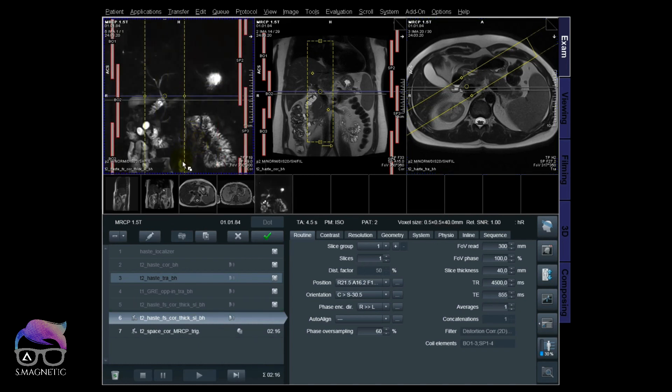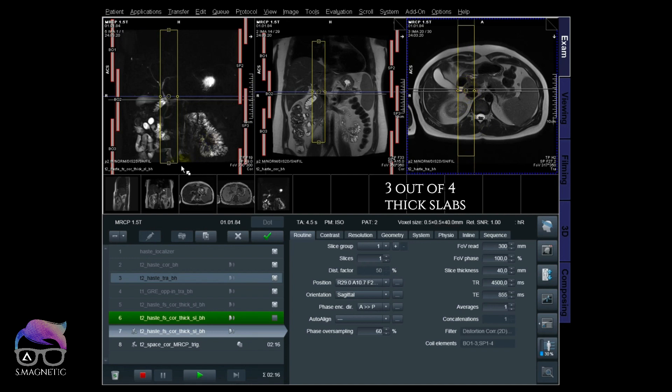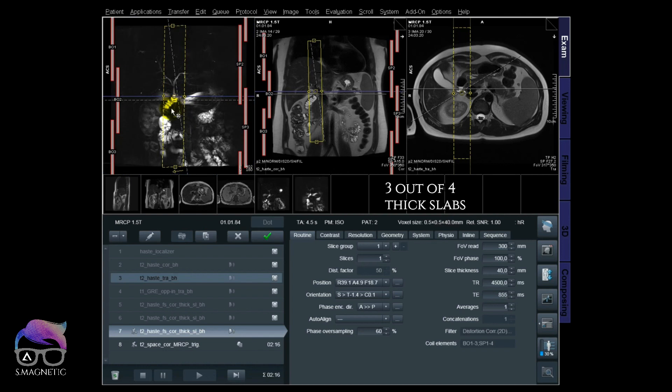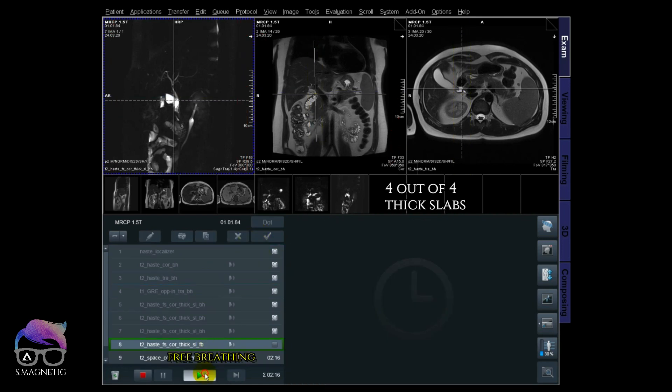That's the first thick slab, and I'm using it to position my oblique coronal, trying to be at the same height of the field of view. I scan that one, then do a sagittal — positioning in the middle — while waiting for the next thick slab. I do a breath hold for that one and reposition it in the middle of the common bile duct. My fourth one is a free breathing thick slab.